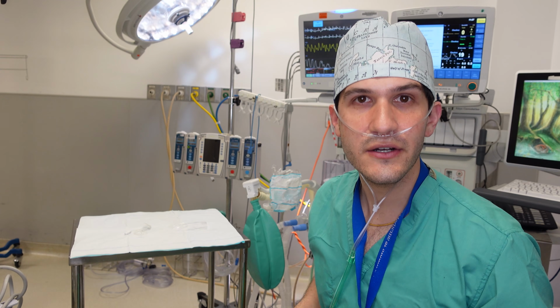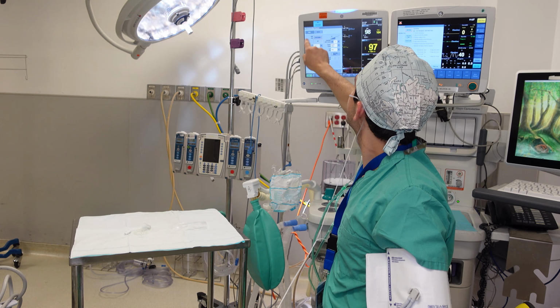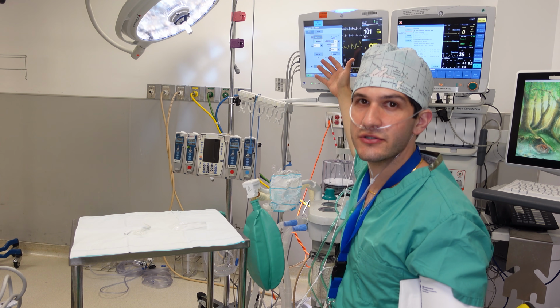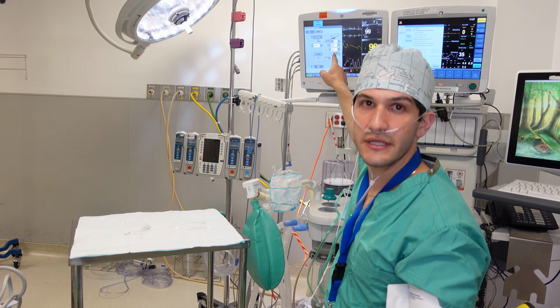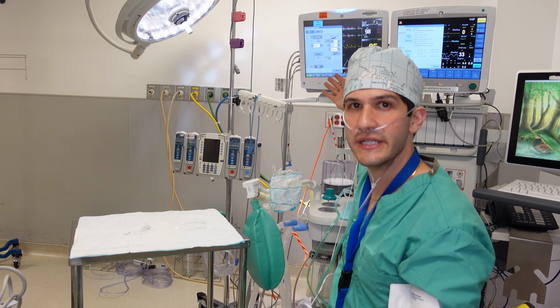Now that I've got this connected, I'll go ahead and take a blood pressure reading. And as you can see here, I'm able to set this machine so that it actually cycles at whatever frequency I'd like it to. And then one of the other important points that I want to indicate here is that I can actually set the volume for when this has completed cycling.